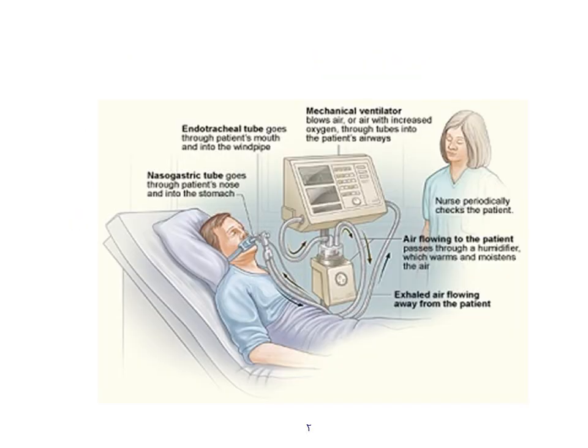This picture clarifies the mechanical ventilator device. On this machine there are different settings that allow for delivering a specified amount of tidal volume, respiratory rate, and O2 through a tube, and this tube is connected to the endotracheal tube that is placed inside the trachea.